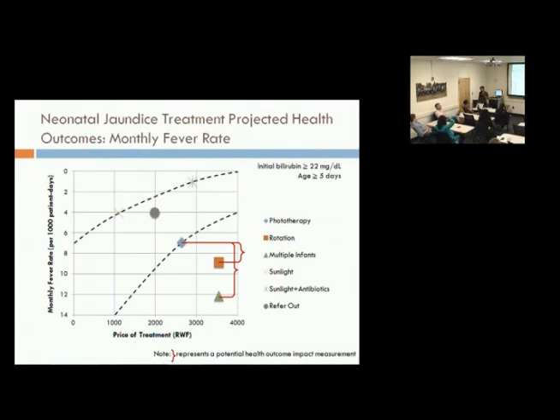Or maintaining. So did you ask the users if they had enough available to them? No, I didn't specifically ask them if they had enough available, but when I asked them why they were using the alternative procedures, sometimes the answer was, the equipment is not working. Sometimes the answer is, we just don't have enough.